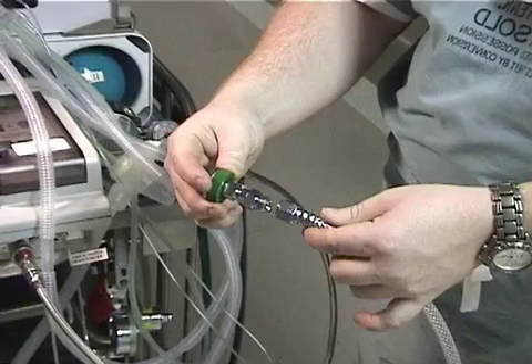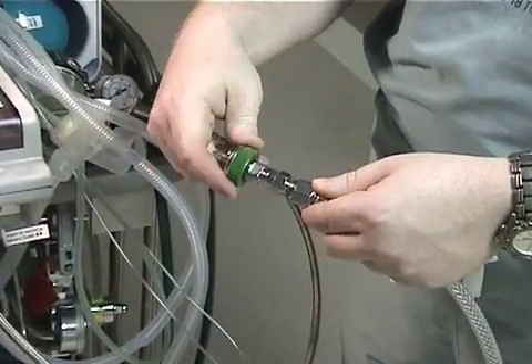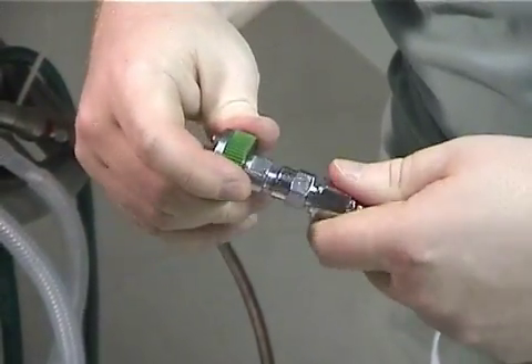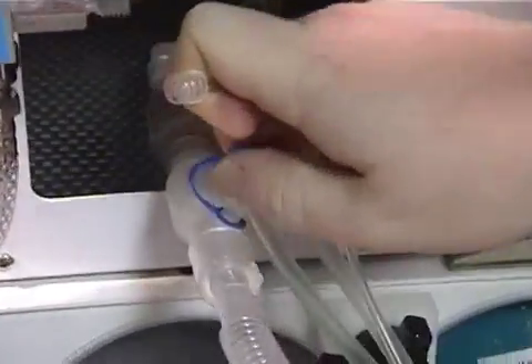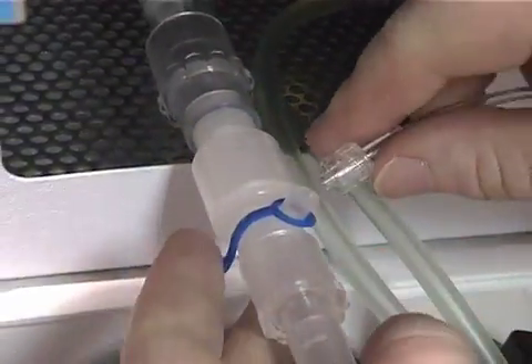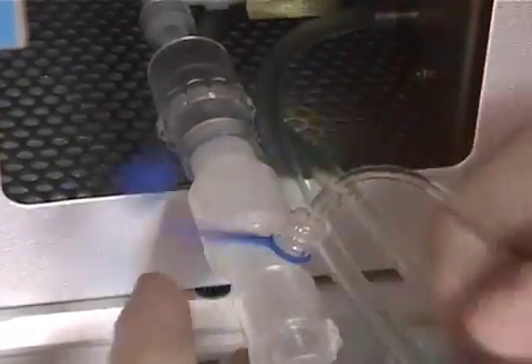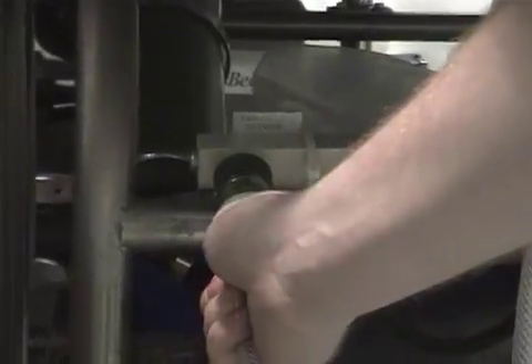With all the components assembled, you are now ready to deliver the nitric. If not already done, you will need to select the appropriate connector to power the vent. With the nitric delivery port connected to the ventilator outlet and the proximal and expiratory lines connected, you are now ready to power the vent.